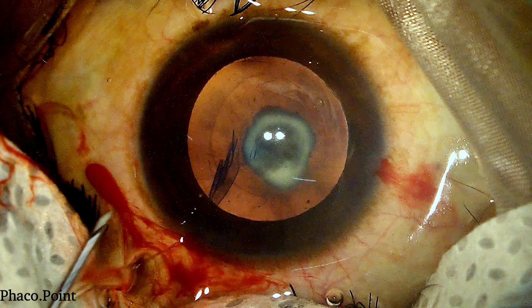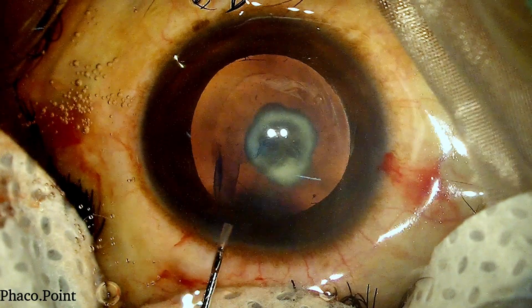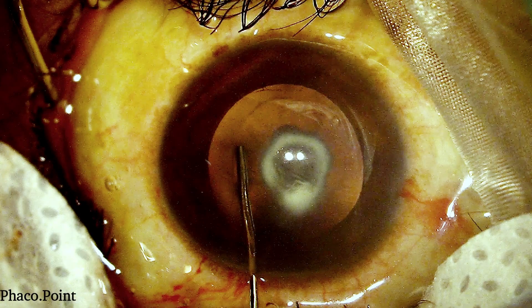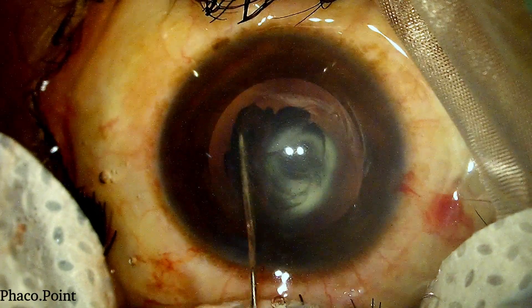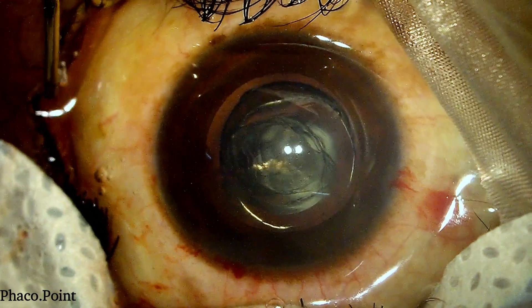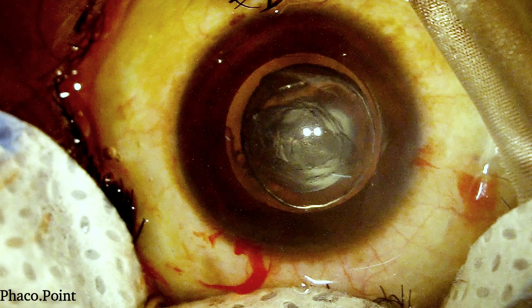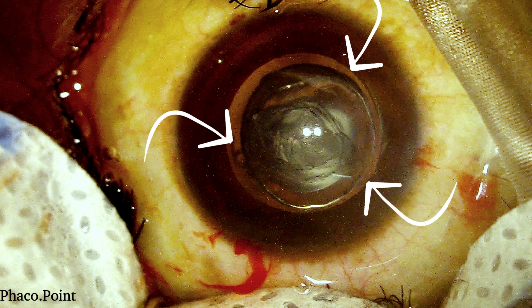We now proceed to performing the hydrodelineation. After gently removing a little viscoelastic from the anterior chamber, the hydrodelineation cannula is introduced and buried into the nucleus to a certain depth. The depth to which it is introduced prior to the injection of BSS results in defining the size of the resultant endonucleus. You need to know how deep to go and where to stop prior to injecting the fluid for hydrodelineation. The end result of a well-performed hydrodelineation is: first, you've created the endonucleus that needs to be emulsified; and second, you've got yourself an epinuclear shell that actually protects the posterior capsule during the endonuclear emulsification.